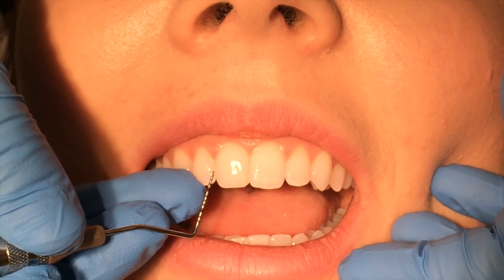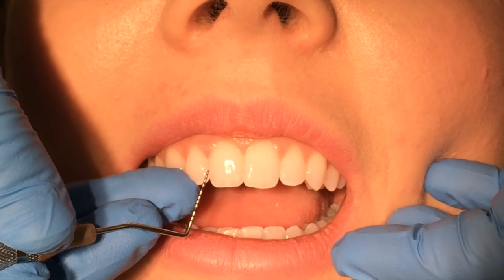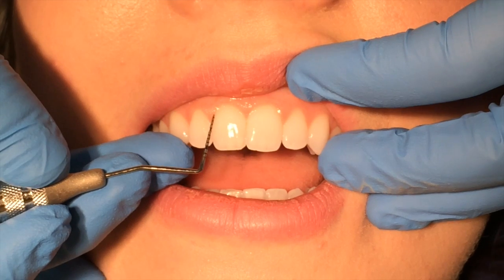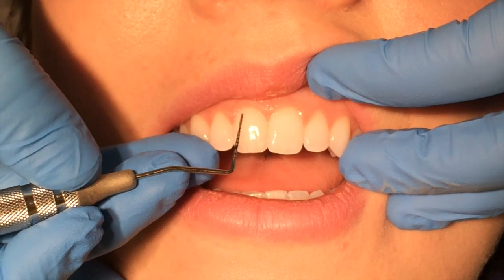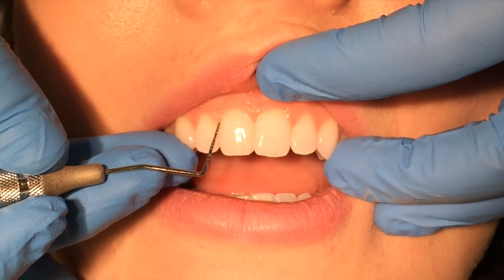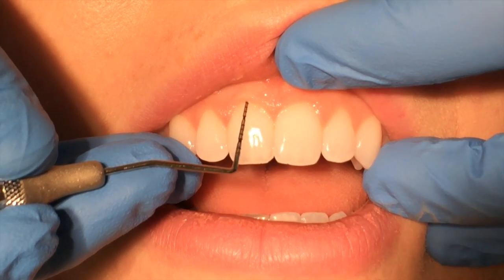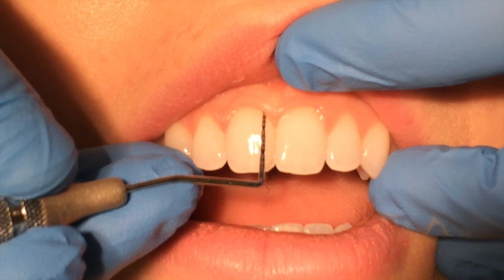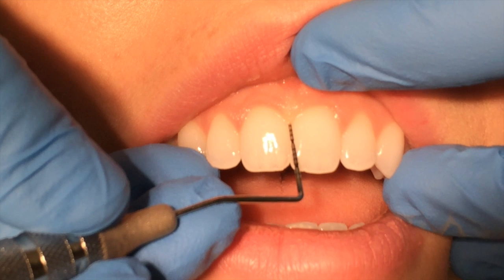Walking strokes are important in order to access the sulcus in its entirety. Often we get in the bad habit of doing a slide across the tooth in order to evaluate the depth. The problem with this is that you are not able to access each area of the sulcus. So you need to bob one to two millimeters across in order to get accurate depths.